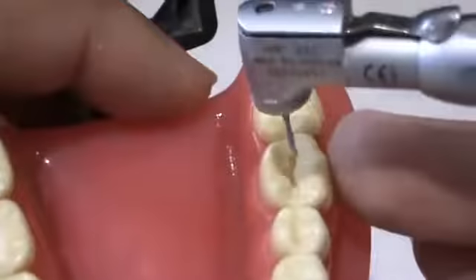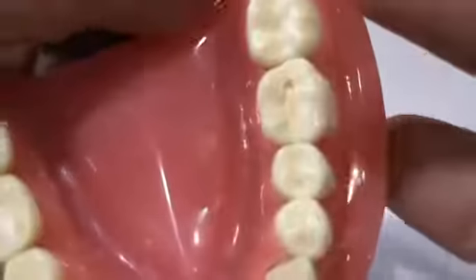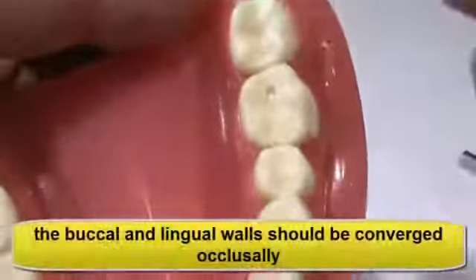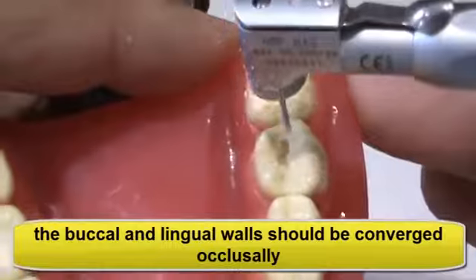This is done by tilting the fissure burr and cutting under the cusps.